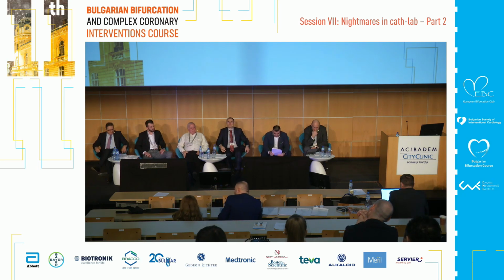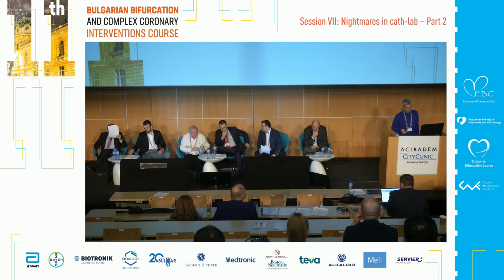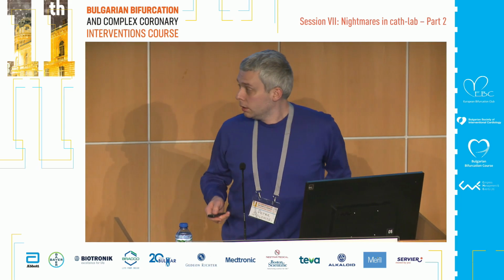The next case will be presented by Dr. Polomsky. And it's going to be endovascular treatment of transcatheter aortic valve migrated into the left ventricle.